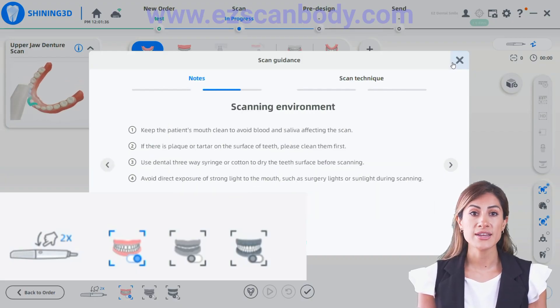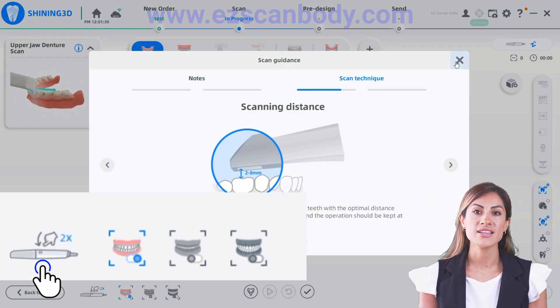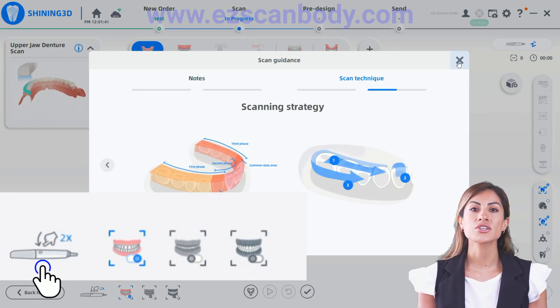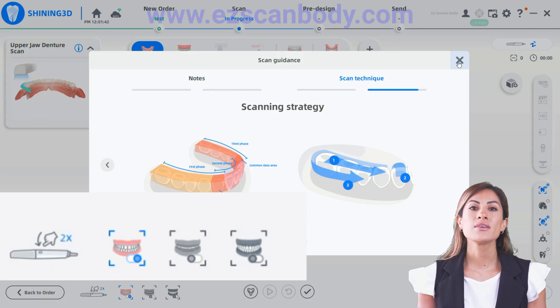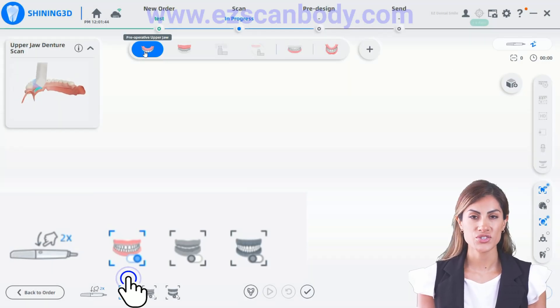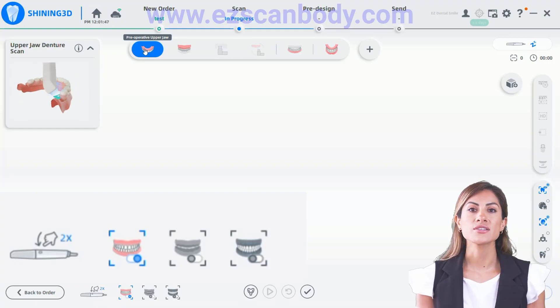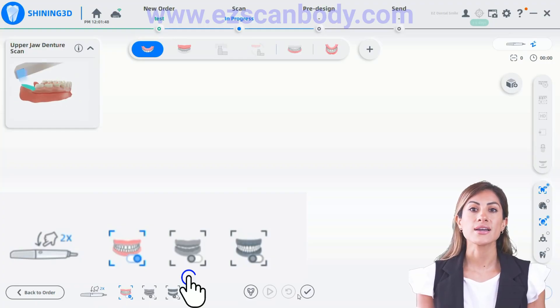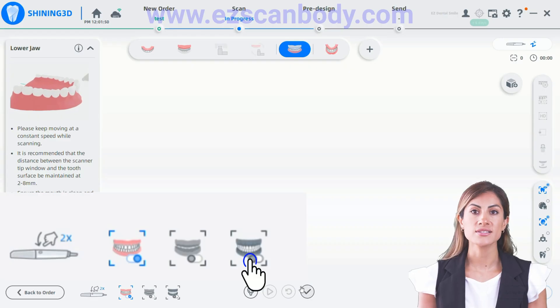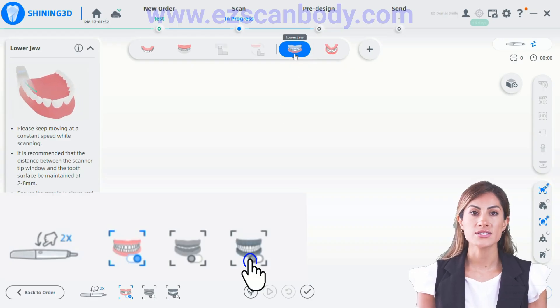If you are scanning models that are not in the patient's mouth, do not select any of the three left options. The first option from the left is for intraoral scanning, while the second one is for denture-less cases. For OronX cases, choose the option on the far right.